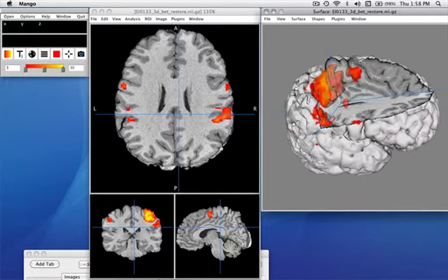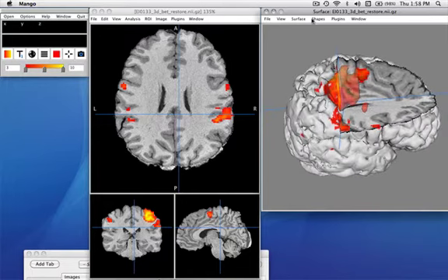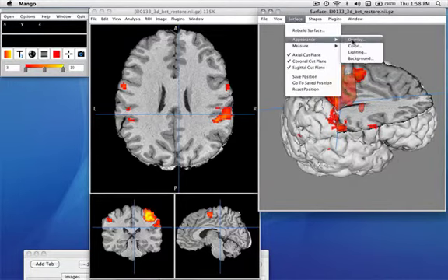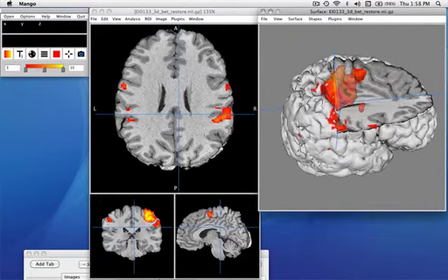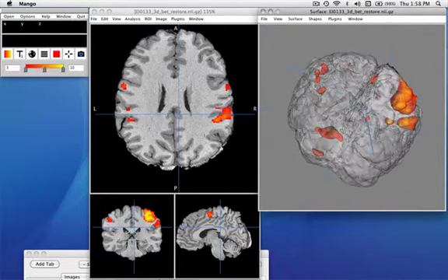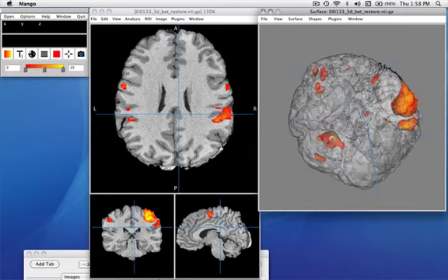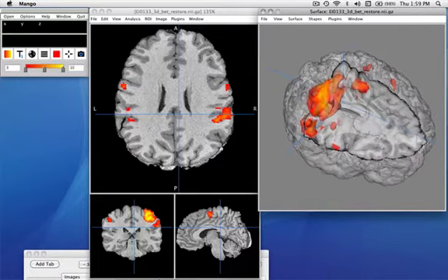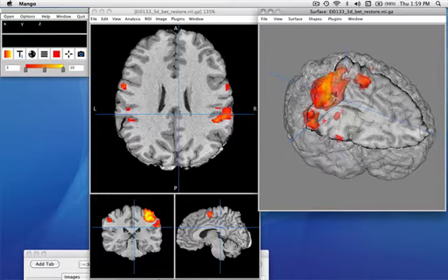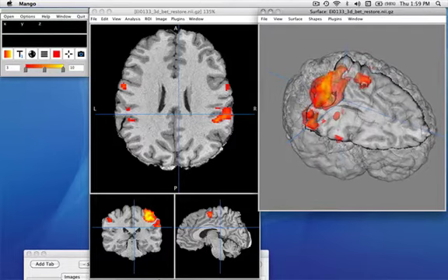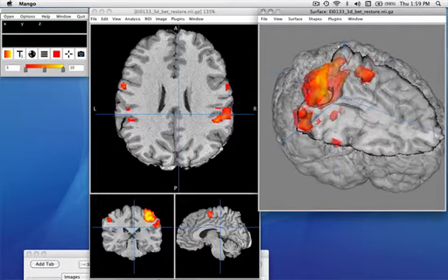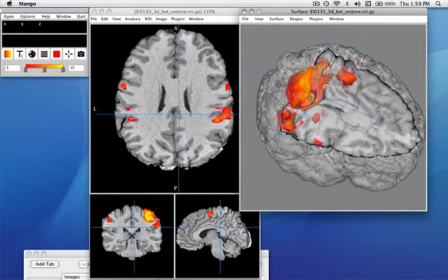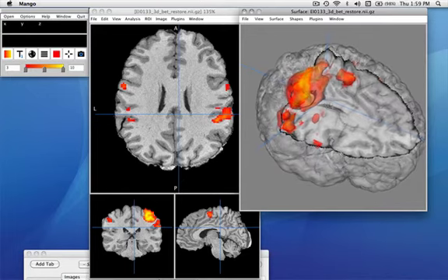There's one other feature we can turn on to help you see things a little bit better. Under surface, we can change the appearance of the surface color so that it's transparent. Now we can see other areas where we have shapes drawn throughout the brain. We can see the slices, we can see the surfaces, and we see the shapes all at the same time. This is a fairly nice feature for Mango in terms of giving overlays, turning overlays into shapes, and providing a lot of tools for 3D visualization.